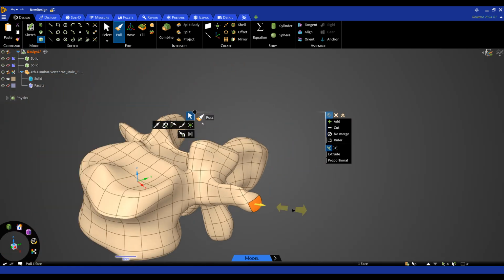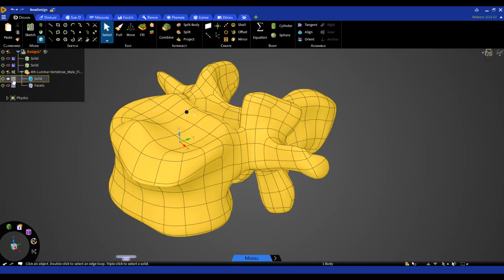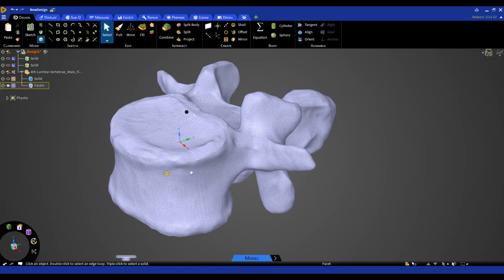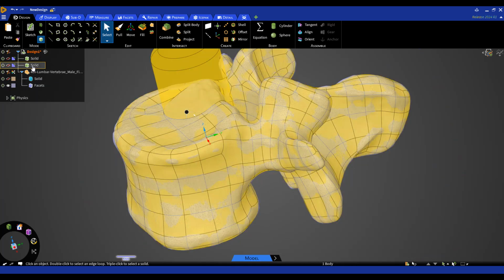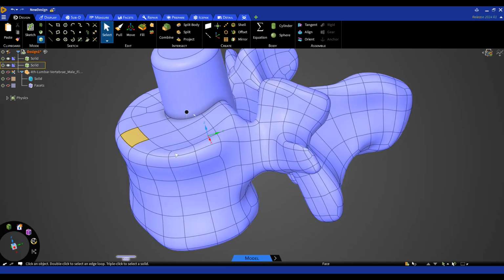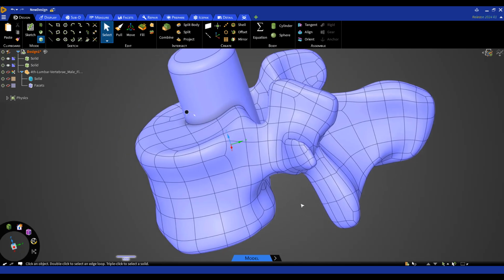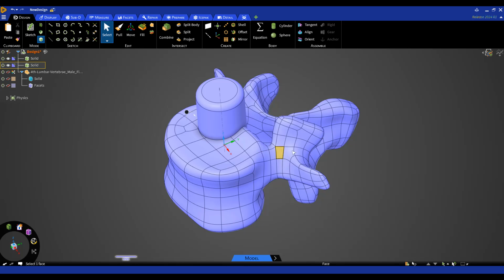So SubD gives you the ability to really create organic shapes, which is ideally suited for organic geometry like body models here, human body scans. We're able to convert easily and very quickly a 3D scan model into a SubD model, and that can be at the end converted into solid models, which can be operated on by standard CAD operations. So a very short example of how we can take a STL from, for example, an NIH database, convert into a CAD model for analysis or integration with existing mechanical CAD, and also modify it as needed in the SubD form to create more organic shapes.